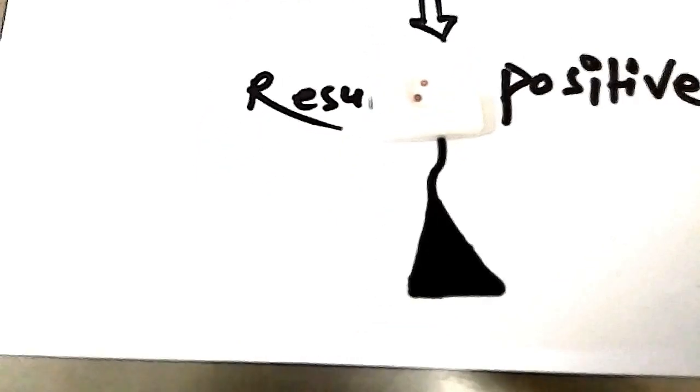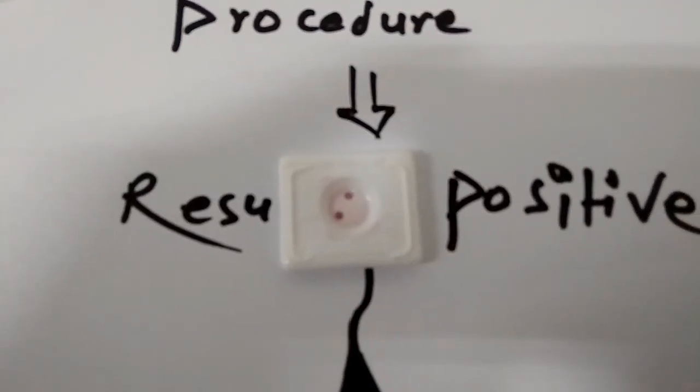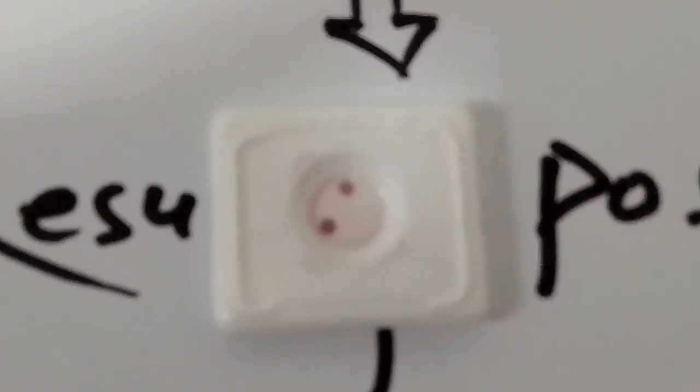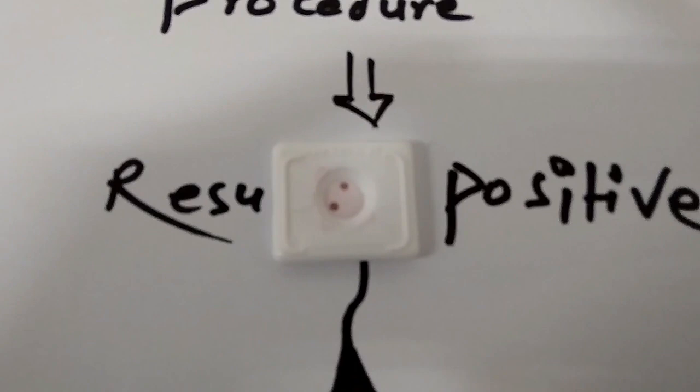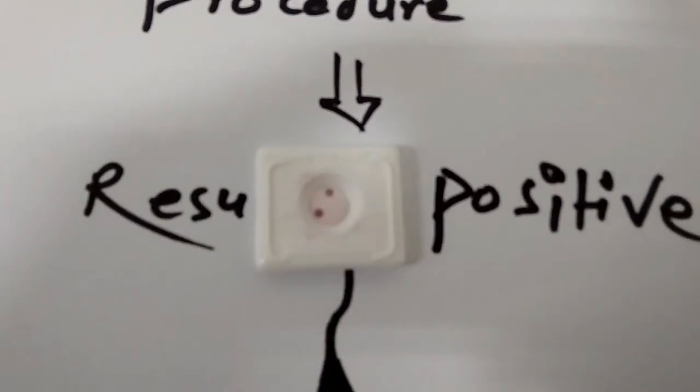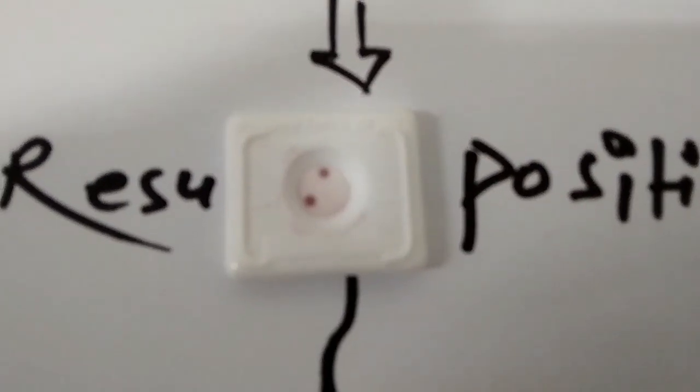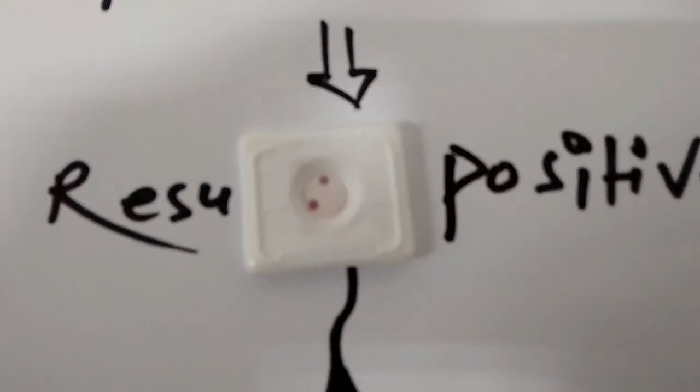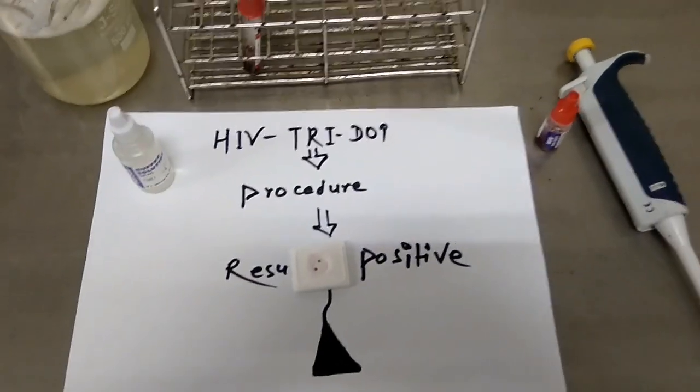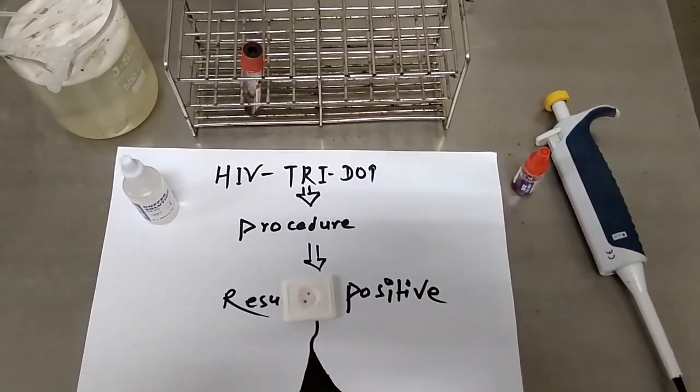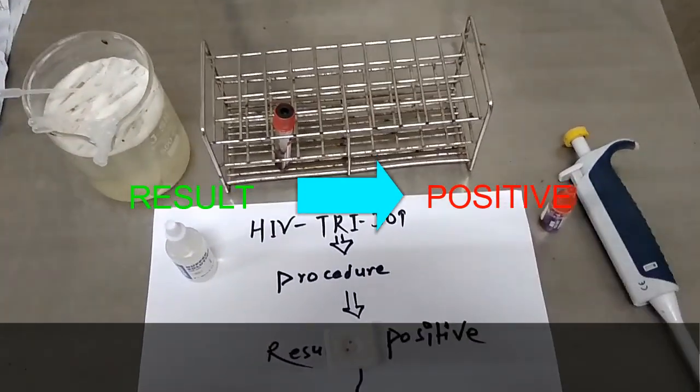Here you can see two pink dots: one is the control region and one is the T1 region. The test result is positive.